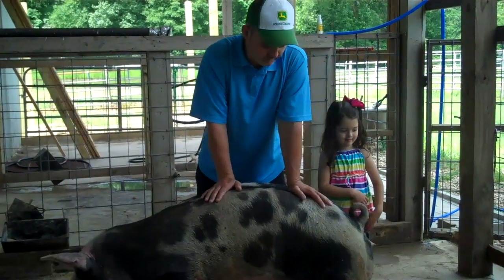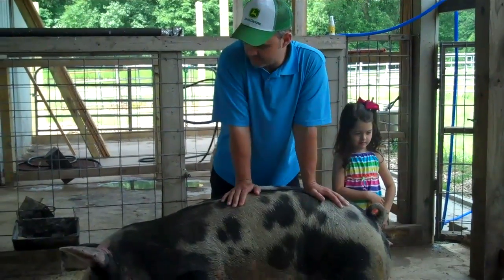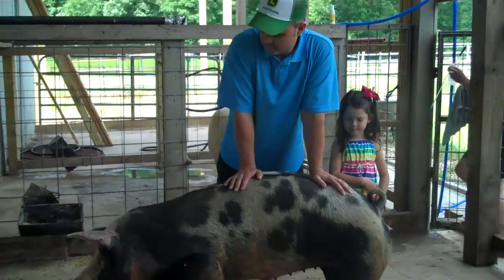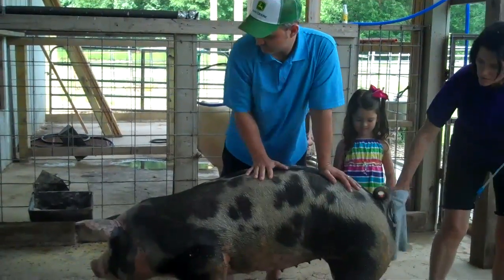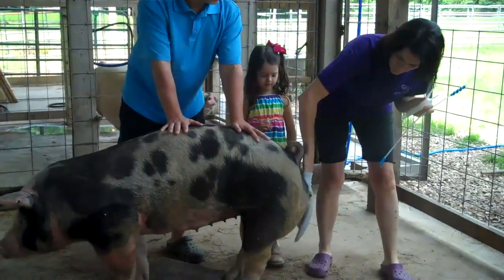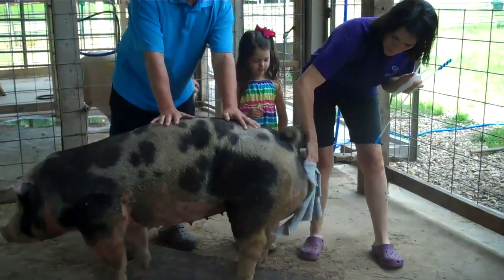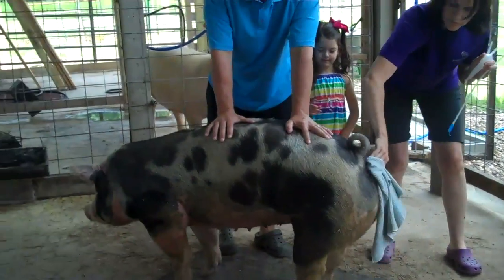Today we're bringing our gilt for the second time. As you can see, she's standing, her ears are popping — she's ready to be bred. We're going to clean her off and get her ready for the insemination.